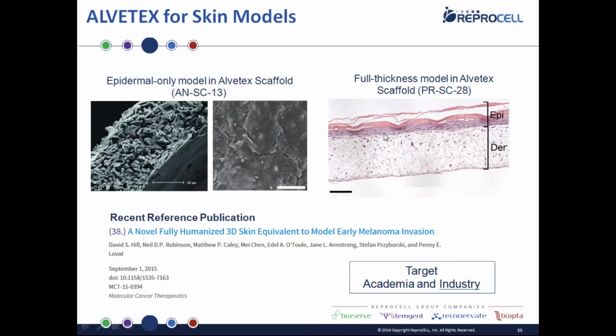You can study interaction between dermis and epidermis, and we have a recent publication which is looking at essentially skin cancer. They've replicated this model and then introduced skin melanoma cells, so skin cancer cells, and looked at the invasion into the dermis. So this is more of a research, academic, health kind of application. So very good for industry, but also for any kind of skin cancer research. It's taken a very long time to develop, but it is now a very good model.